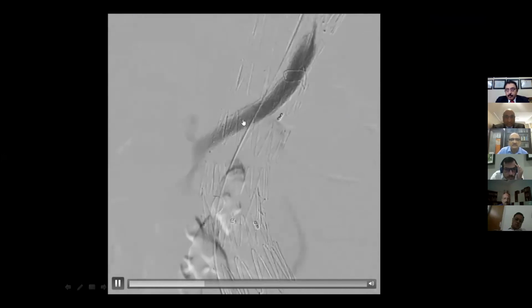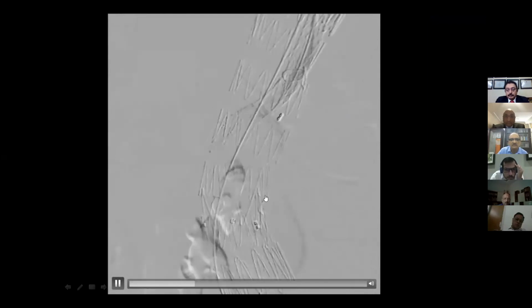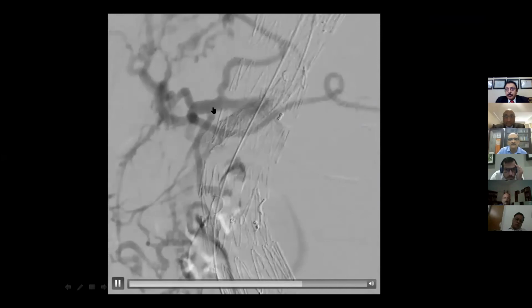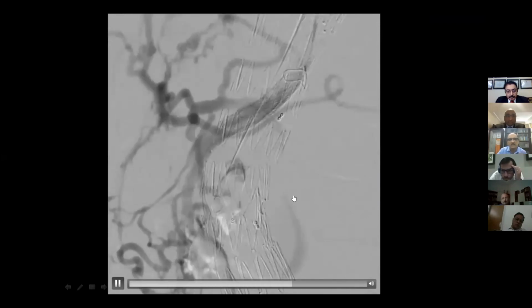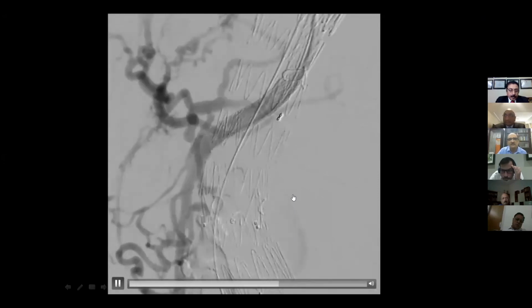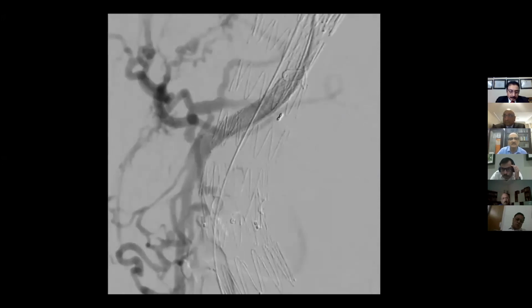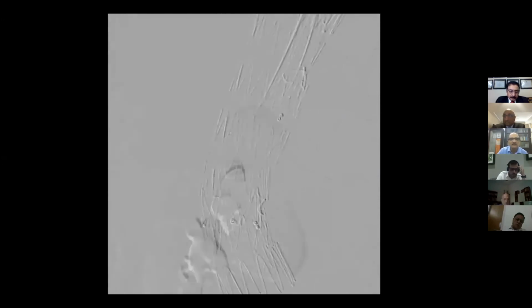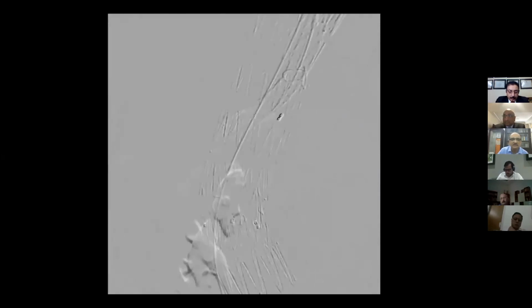When you inject contrast into the superior mesenteric, it fills the celiac artery later on, and you can see the celiac artery filling at the back a few frames later. So we were not able to cannulate the celiac artery, and then we decided, okay, the celiac territory is anyhow getting supply from the superior mesenteric territory, and its mouth is very narrow, so let's ignore it.